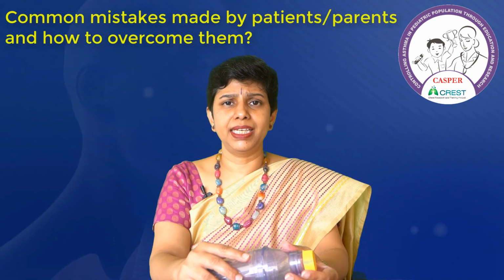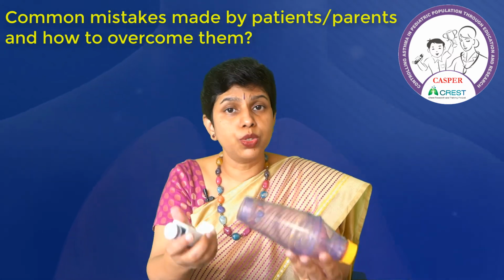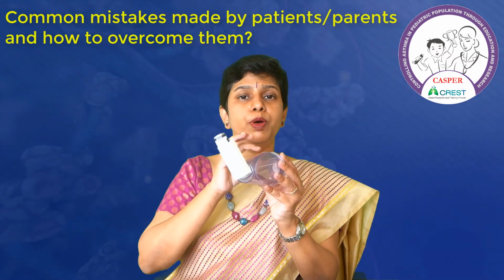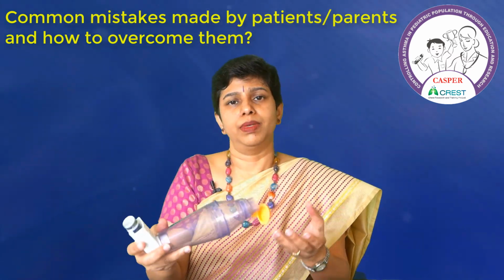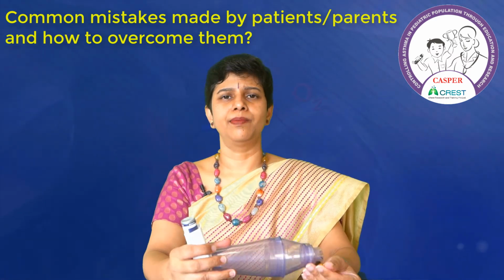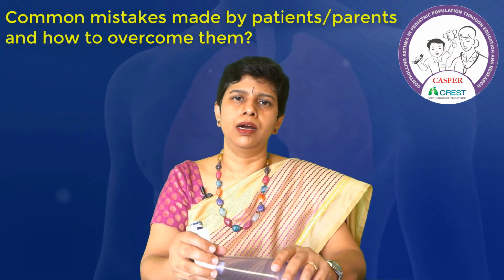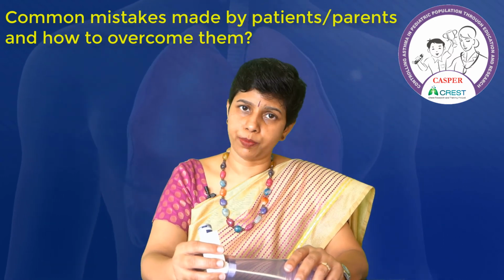I would like to reiterate here that every time the patient comes to you, please make sure that they show you how they are using it. There are n number of mistakes that they will make. They will not open this. The child will just keep on blowing into it. It's not going to help. So make sure that you see how the child is using it every time. Also inspect the device every time for any fungal growth or anything abnormal, and guide the parents appropriately.